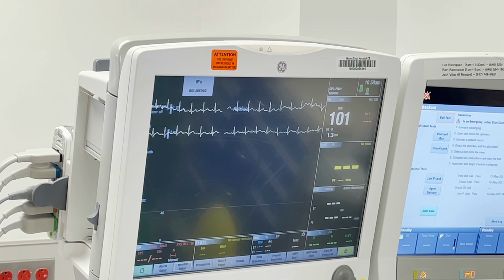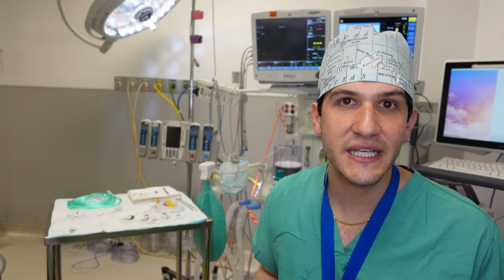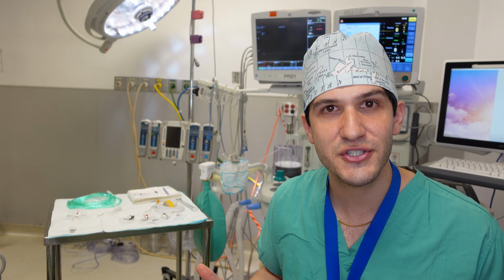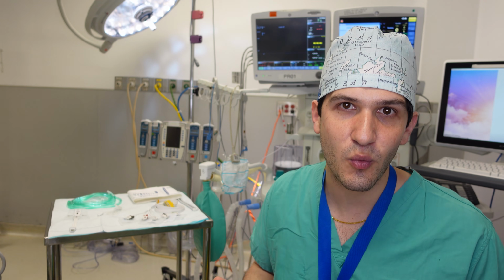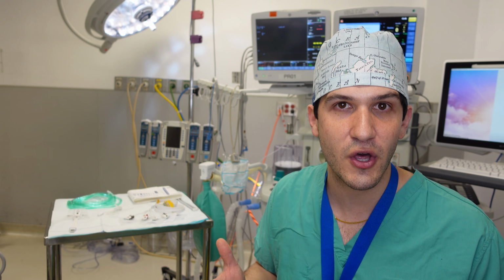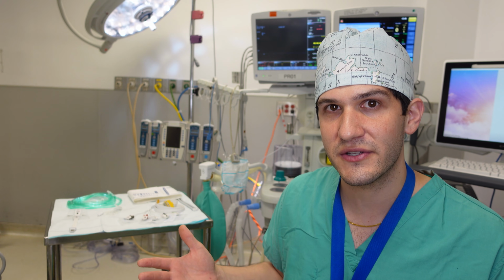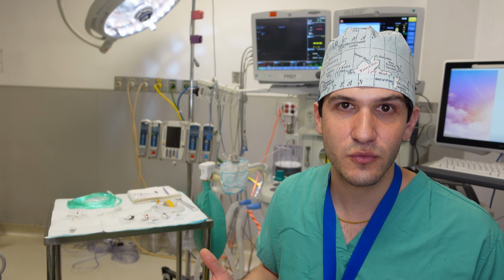This is extremely important to me as an anesthesia resident because that allows me to understand whether there are any sorts of pathologies that are going on with the heart during surgery. Now, surgery can be an extremely stressful process on the body, which can increase the demand on the heart and increase oxygen consumption in the heart. If there's not enough oxygen supply and consumption outweighs the supply to the heart, which is of course a muscle, then that can lead to electrical conduction abnormalities, that can lead to parts of the heart not getting as much oxygen as it needs to, and then it stops working as well as it needs to, which in the worst case scenario can lead to an intraoperative myocardial infarction, which is of course an emergency.